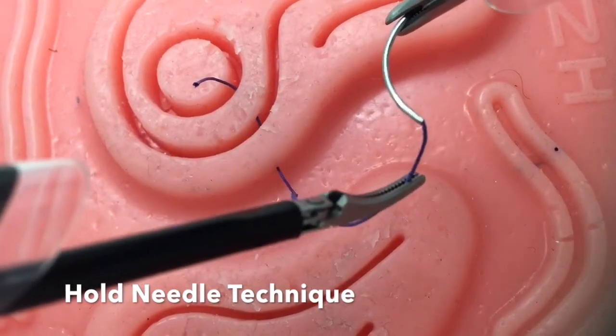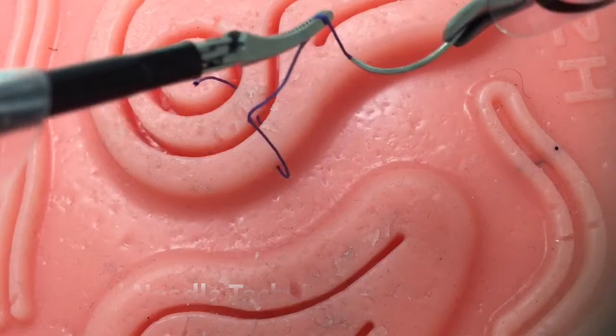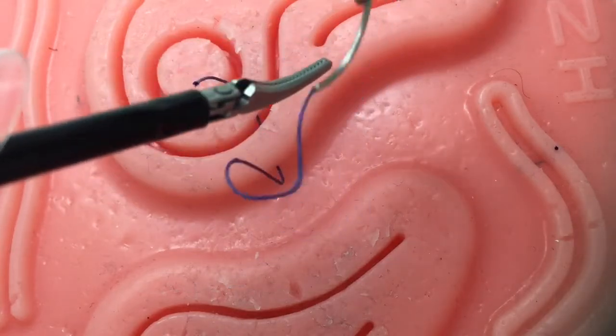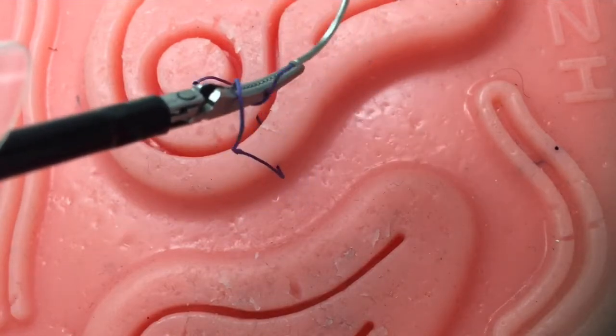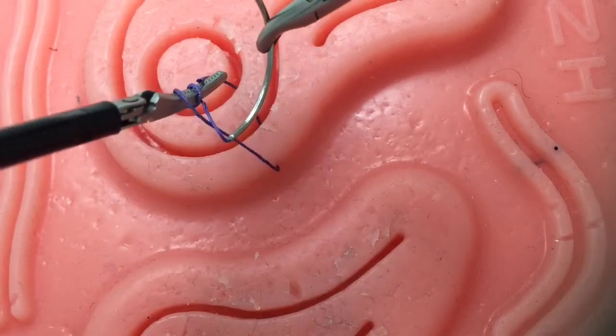The key principle is to rotate the needle to line with the suture and to minimize the instrument-to-suture angle. By creating this almost parallel angle and utilizing the sturdiness of the needle, wrapping your suture around your left instrument becomes virtually effortless.